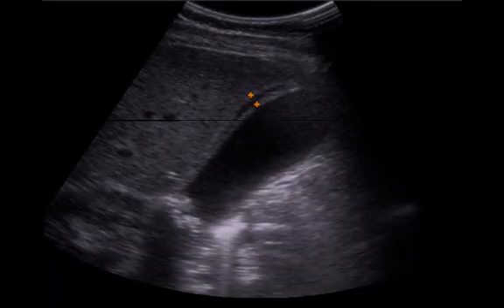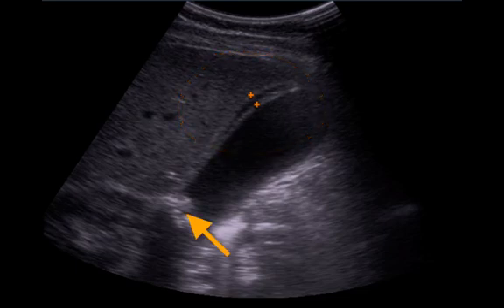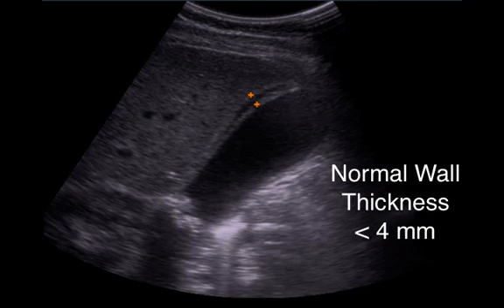In this third ultrasound image, we see the medium echogenicity of the liver parenchyma towards image left, with the anechoic tubular lumen of the gallbladder directly toward its right and situated in the center of the image. Here, we are looking at gallbladder wall edema secondary to a gallstone in the neck. As signified by the orange calipers on the screen, the anterior gallbladder wall is thickened, here approximately measured at 7.1 millimeters. Recall that the normal gallbladder in a healthy individual measures less than 4 millimeters.